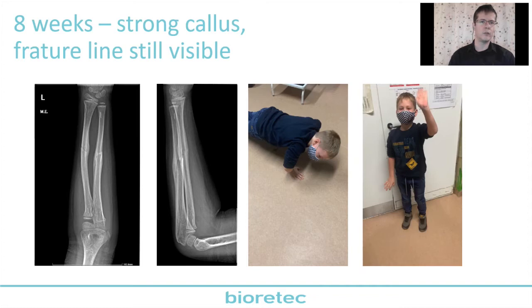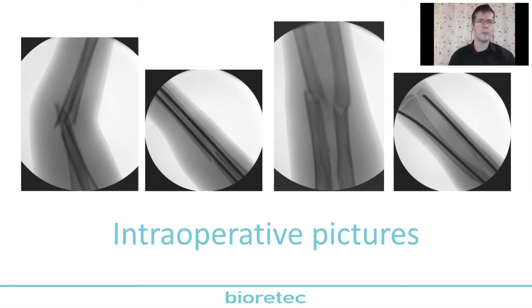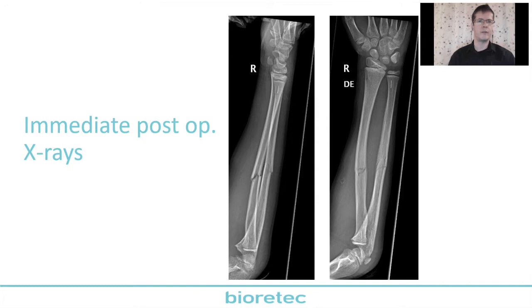Next slide. She was an 11-year-old girl, a very elite sports girl. She fell during sport activity, and she suffered this unstable fracture. Next slide, please. We have chosen intramedullary IM nailing. Here we can see the intraoperative pictures. Next slide, please. And here we can see the postoperative X-ray. And this is the immediate postoperative X-ray.